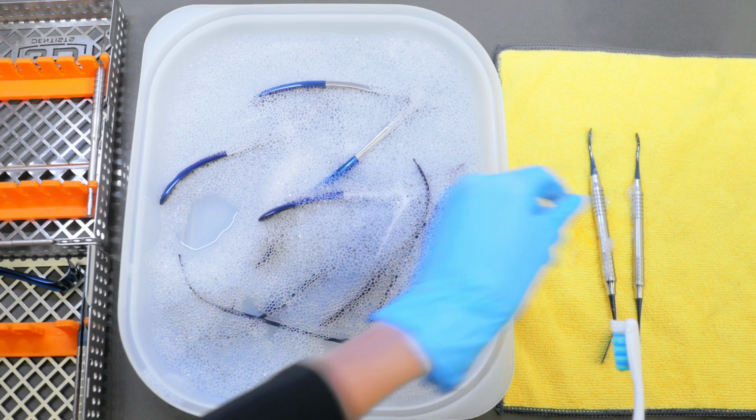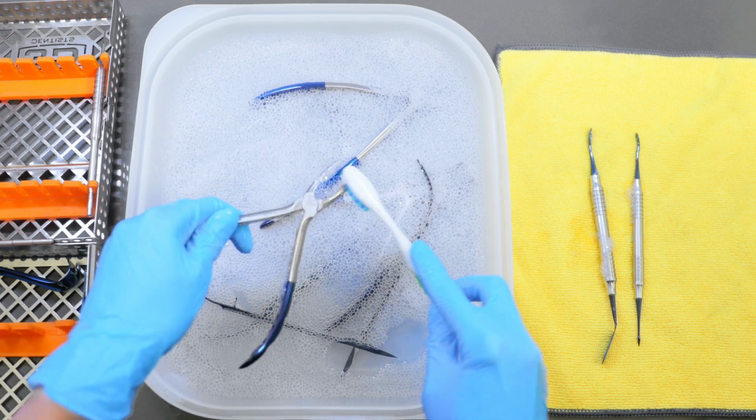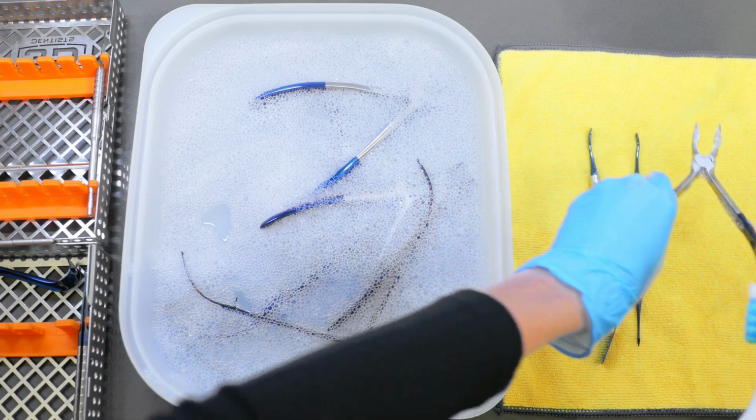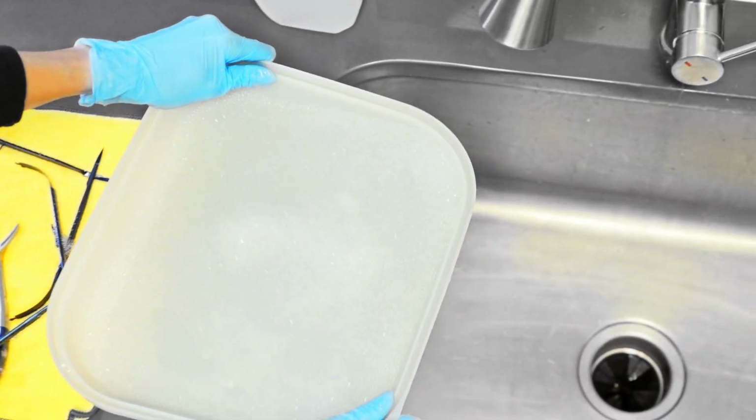All hinged instruments must be in an open position in the soak bath. We recommend using only nylon or plastic brushes when cleaning your instruments in the soak bath. Clean detergent solutions must be used for each cleaning session to prevent any cross-contamination.